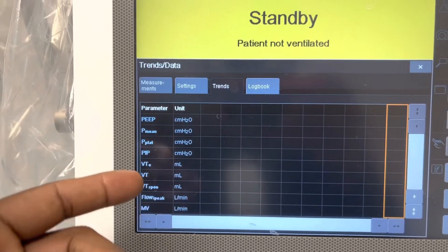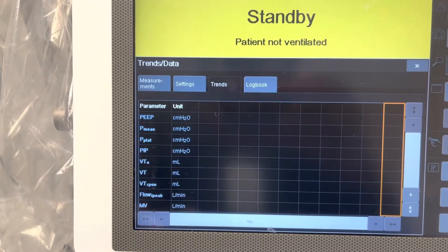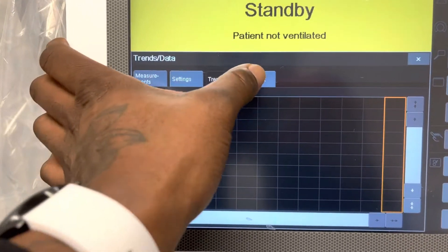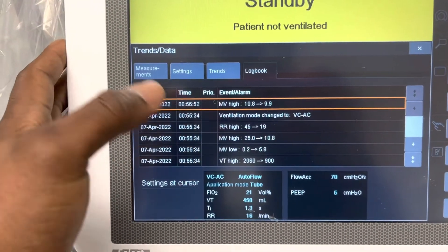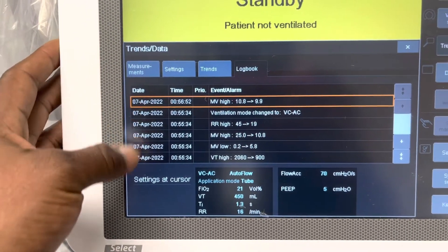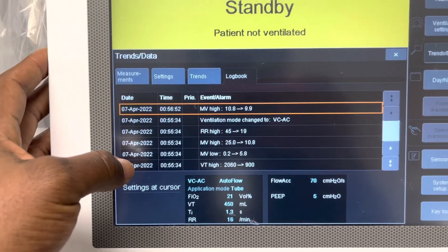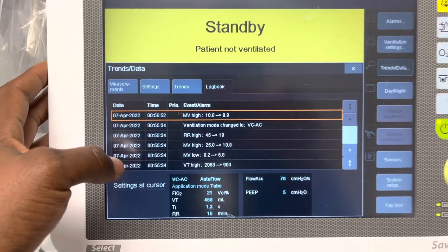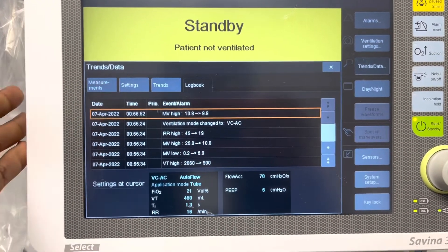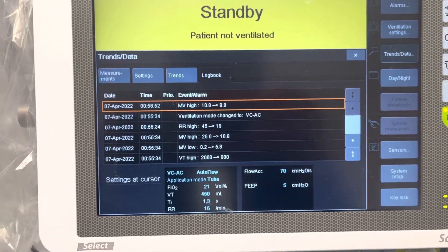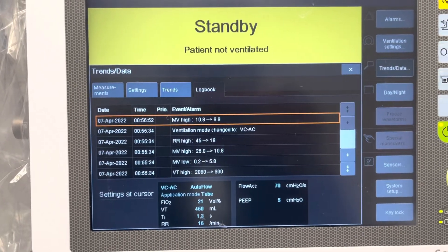If there was a patient on the ventilator and they were actually giving us some trends, we would be able to map that. These are the alarms that were set off during the course of the patient being on the ventilator.